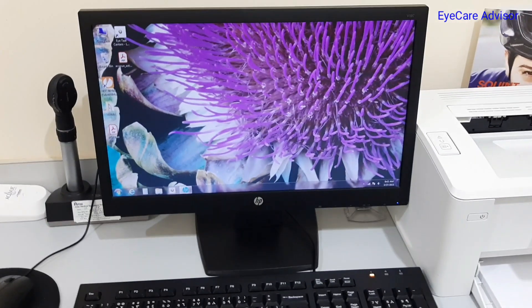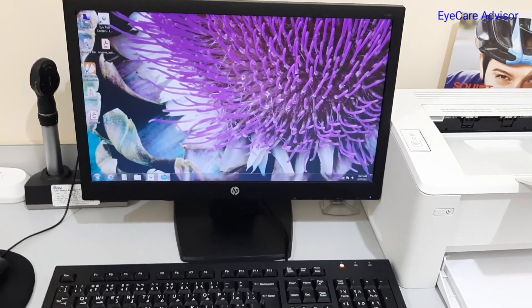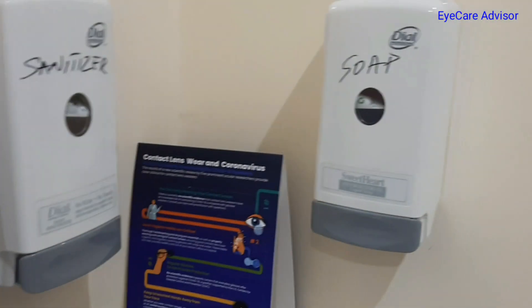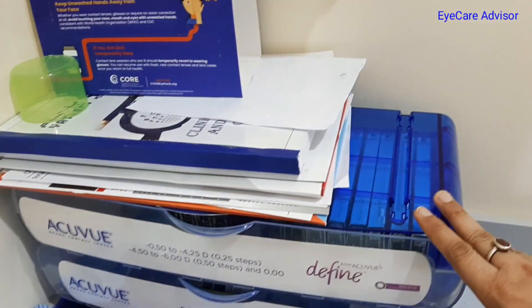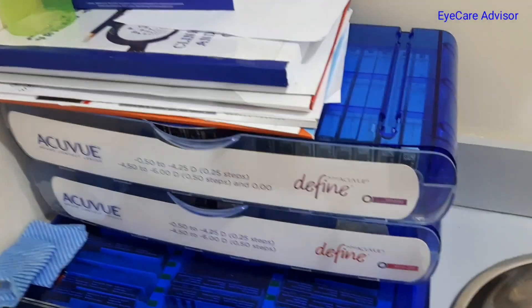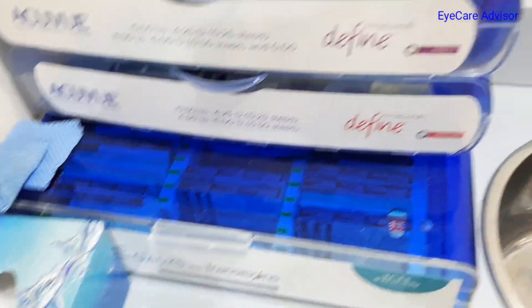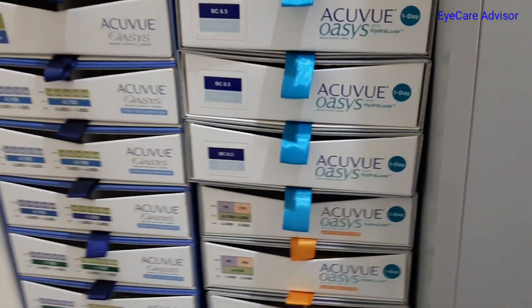It is convenient to find records here. We also have the sanitizer and soap. Here are some of the trial lens sets — including transition trial lenses and more trial sets.